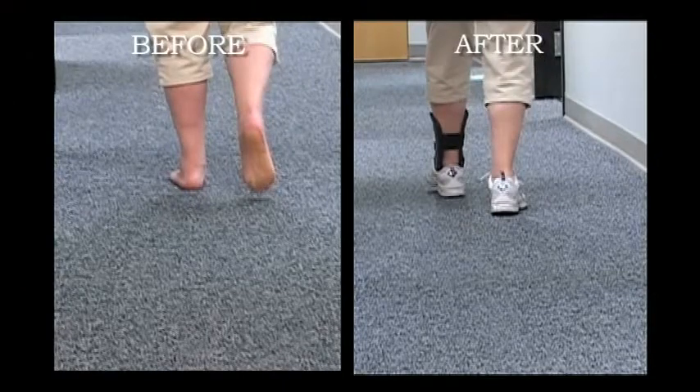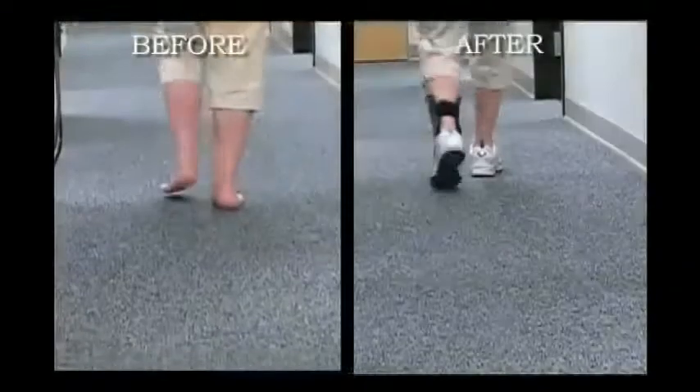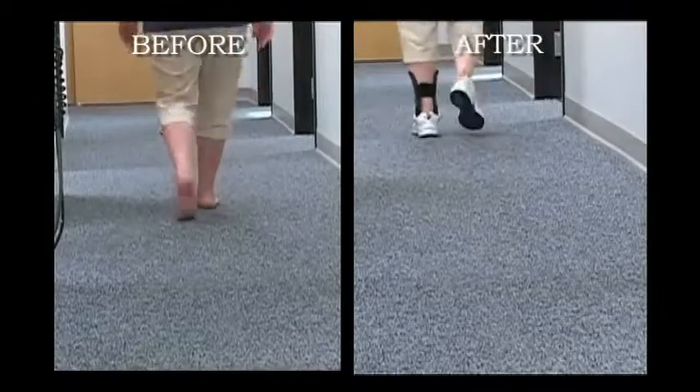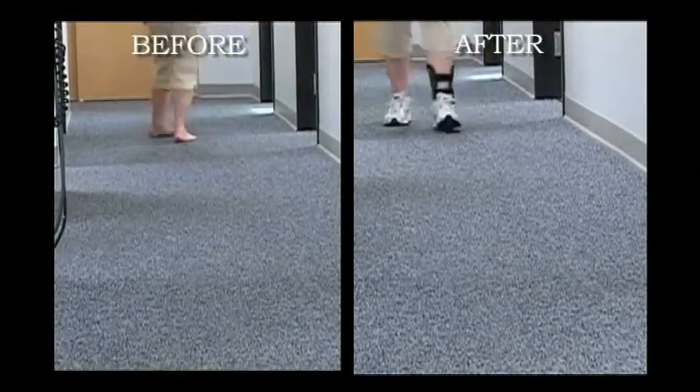A patient with stage 2 adult acquired flat foot can be successfully treated with the standard hinged Richie Brace. The control of the foot is demonstrated both during swing phase and during the stance phase of gait.